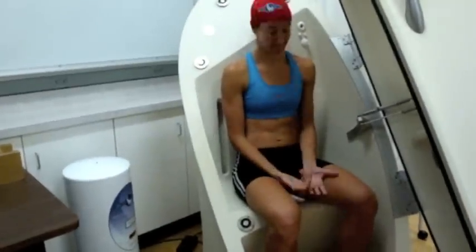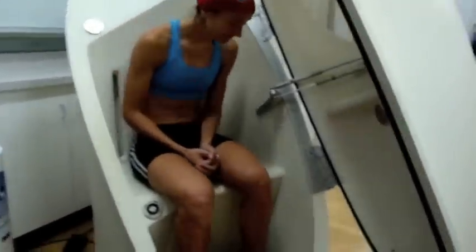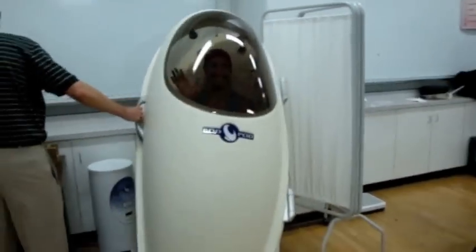The subject sits comfortably in the measurement chamber during two runs. Each subject run takes less than one minute. The two runs are then averaged. This test is contraindicated for those with claustrophobia.